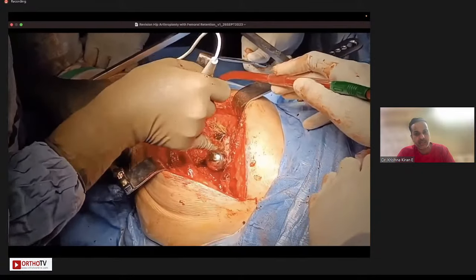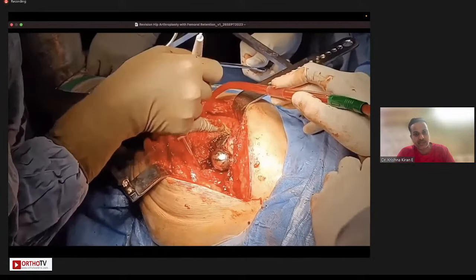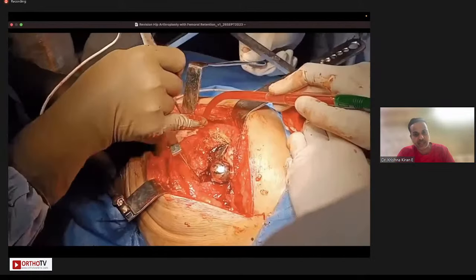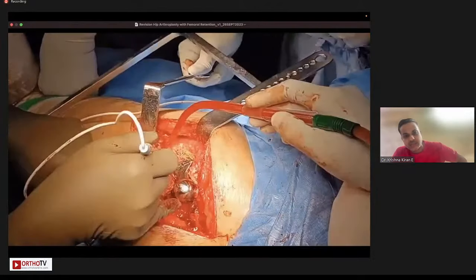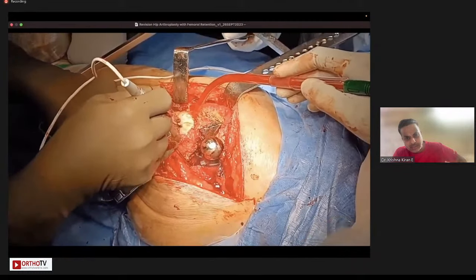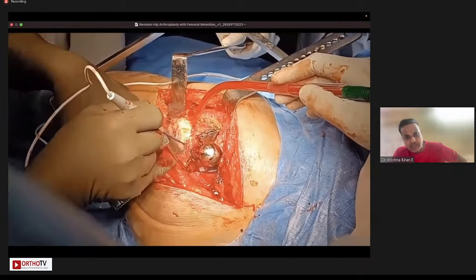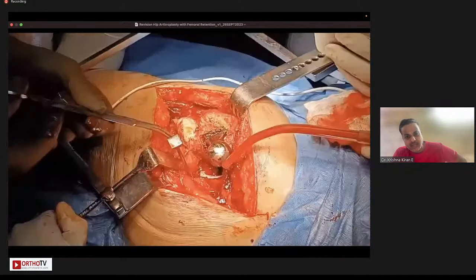So you see here, I'm releasing the gluteus maximus and completing the gluteus maximus release from the linea aspera attachment. And here the surgeon must be careful about the presence of the first perforator. Once you do that, now you are dissecting on the femur and you can see the psoas is coming into vision. And typically between the psoas and the anterior capsule, you dissect.